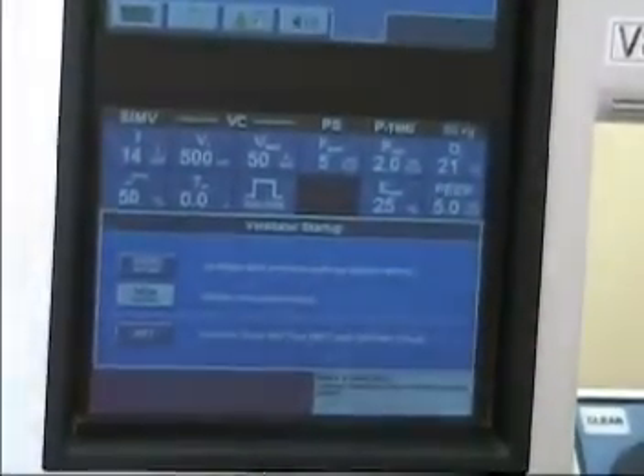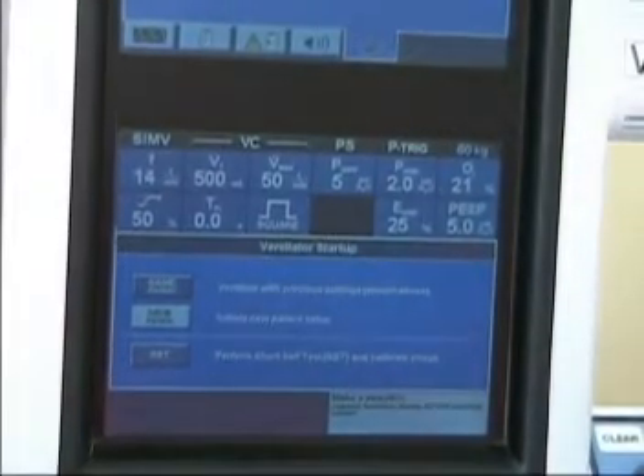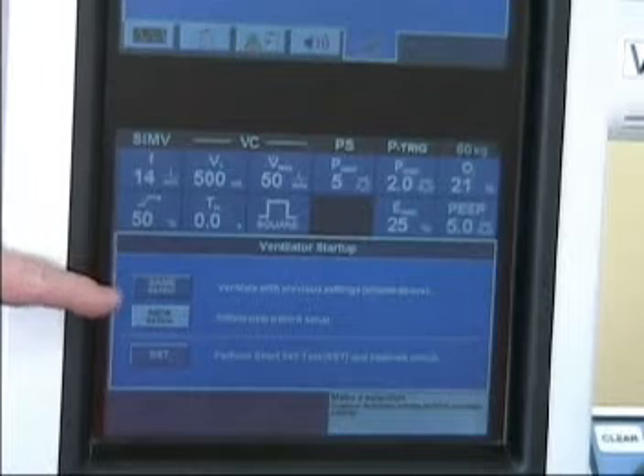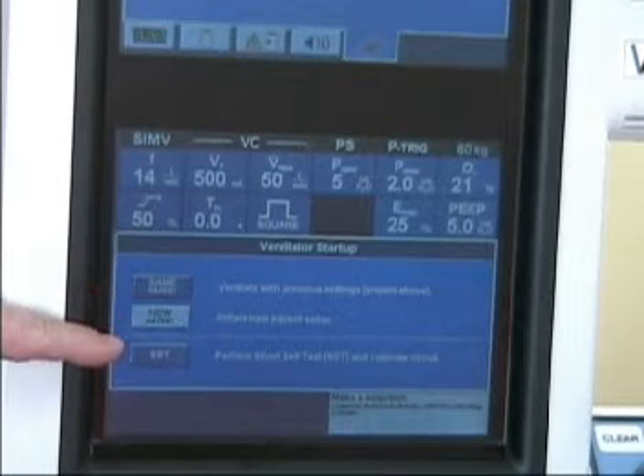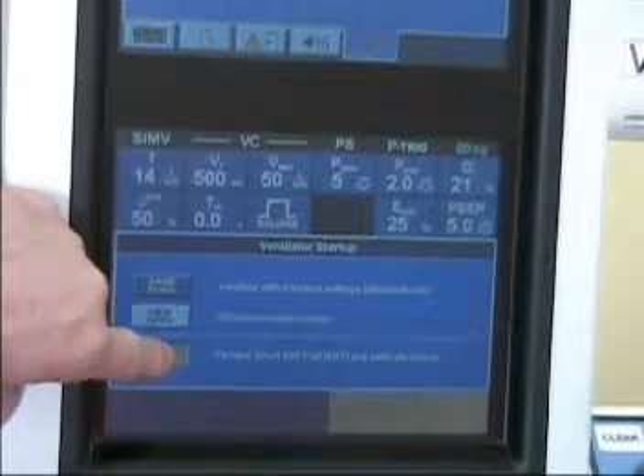We want to take a look at the bottom portion of the screen. It says 'same patient,' 'new patient,' and 'SST.' This is the short self-test — we'll press on that.